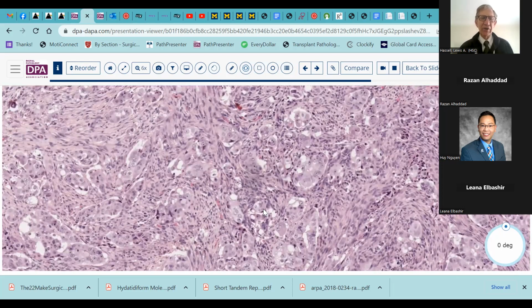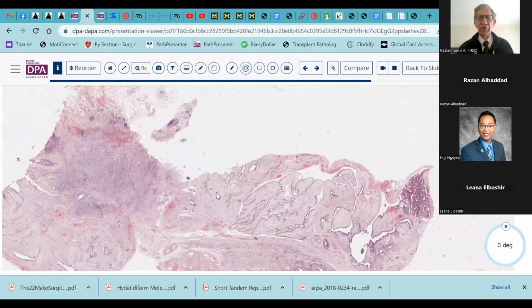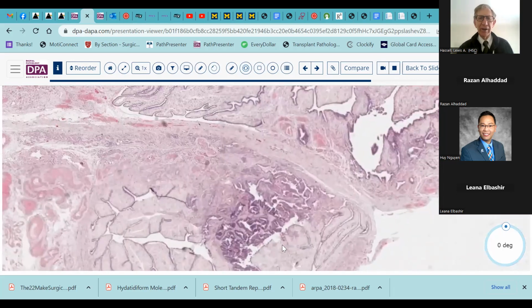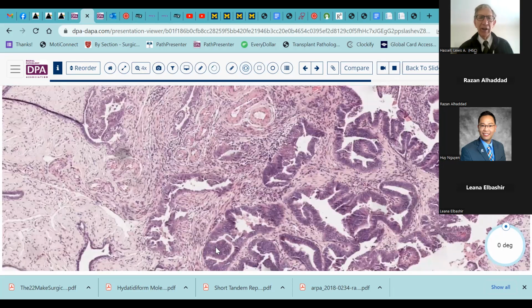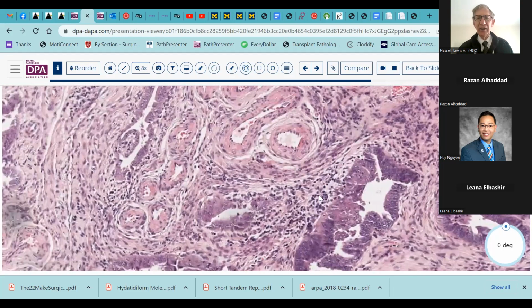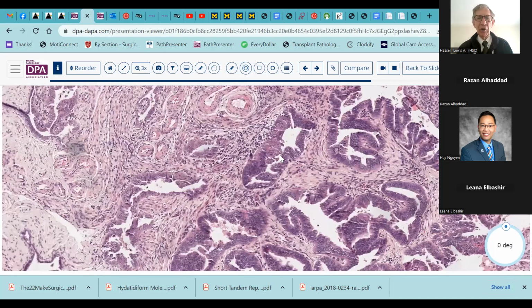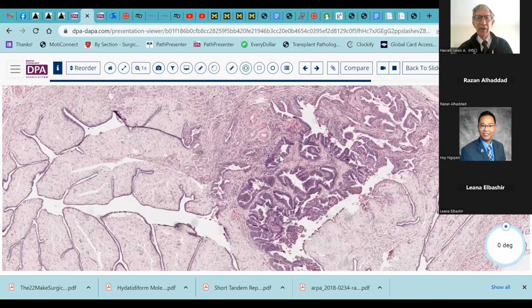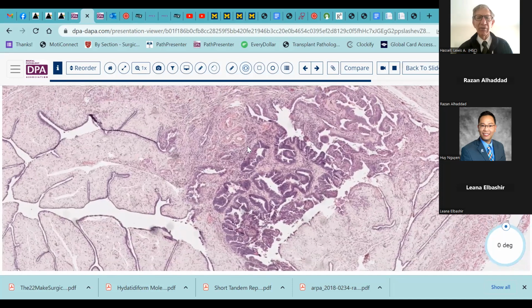and so the diagnosis was not in question, but is it a fallopian tube origin? Well, right here we've got this area of tubal intraepithelial neoplasia, and probably more than tubal intraepithelial neoplasia, we probably have, based on the juxtaposition to these vessels, an invasive carcinoma that is a serous carcinoma. So defining invasion in the fallopian tube is very difficult. And I think you could look at a case like this and go, I'm not totally sure that that's invasive.